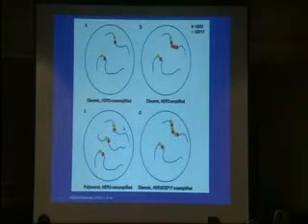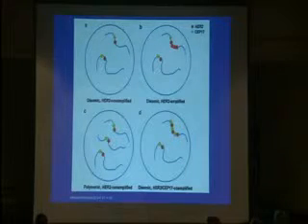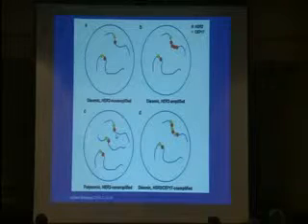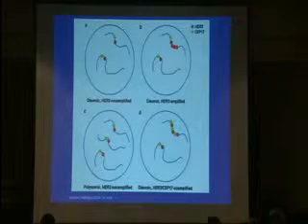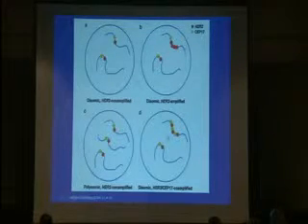Figure C, you see, instead of the usual 2 strands of chromosome 17, you see 3. So this is an example of polysomy of chromosome 17, an extra copy of the entire chromosome. However, if you look at each chromosome, it has only 1 signal of each. So if we calculate the HER2 ratio in figure C, it will come back non-amplified. Correct?